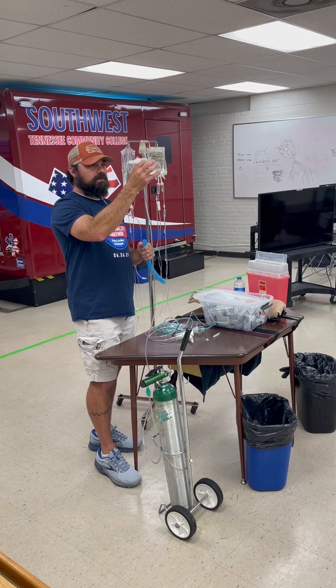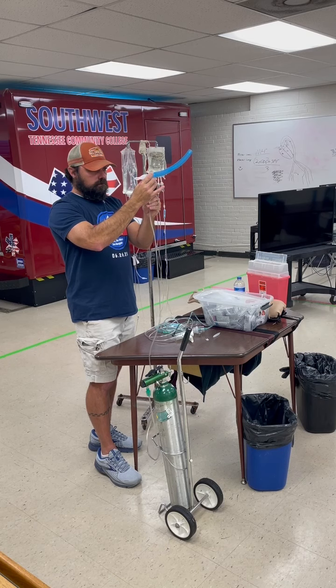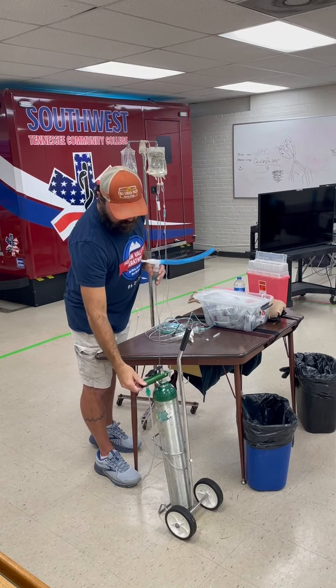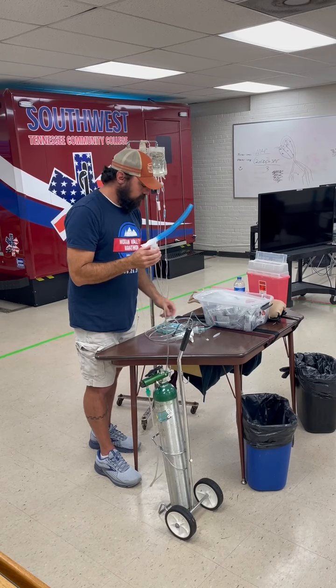6 to 8. So what's your goal for this? You wait until you get a mist. That's the bottom line. So you turn up to 6, no mist. All right, we're going to go to 8. This is not a very good mist. Say this one's broken, man. Doesn't matter on this one. All right, so it should have a mist. If it doesn't have a mist, I don't know, find a different one.